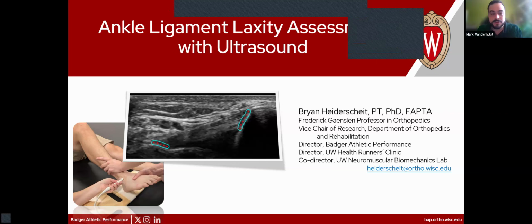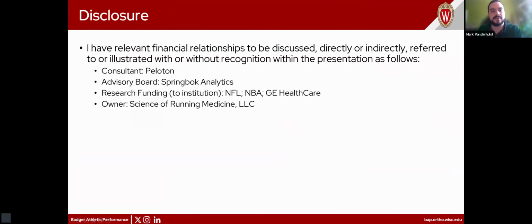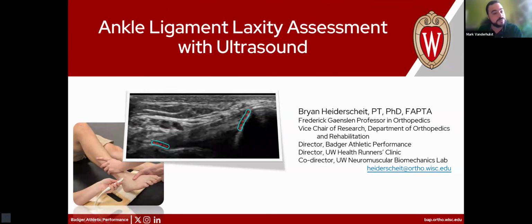I am the marketing director for the point of care ultrasound business in the US here at GE HealthCare. And we are incredibly excited to be partnering with AMSSM to be able to bring you today's educational webinar, talking a little about how ultrasound could be used in ankle ligament laxity assessment.